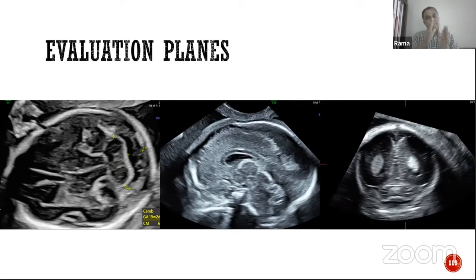And this is a very simple sign, and we need to document this plane as well when we do the occipitobregmatic plane. Because if this side-to-side length is replaced by AP length being more, then that is associated with posterior fossa abnormalities, and that becomes a kind of screening feature for the posterior fossa in particular. So that's as far as the axial goes.